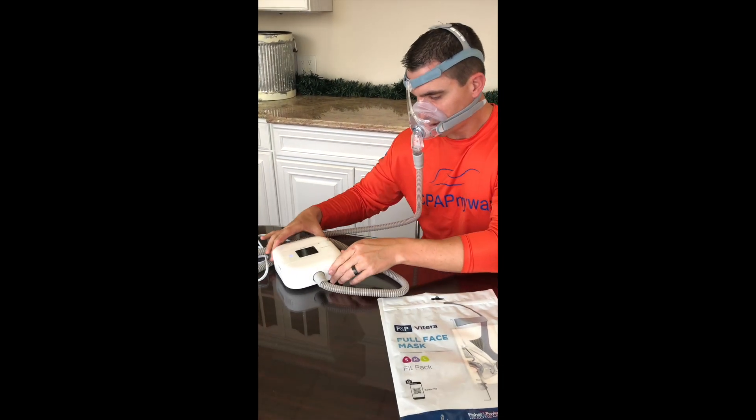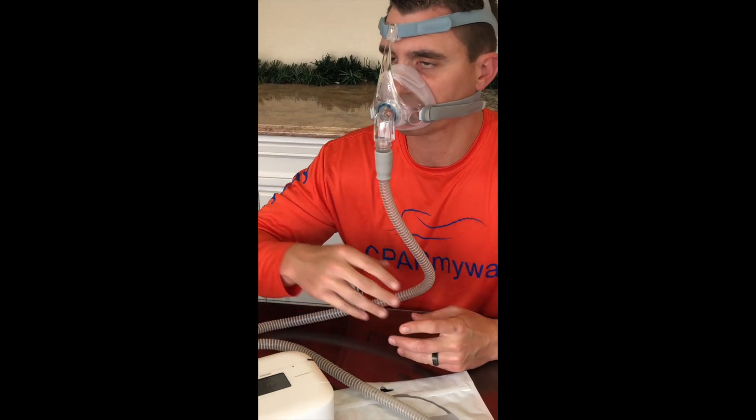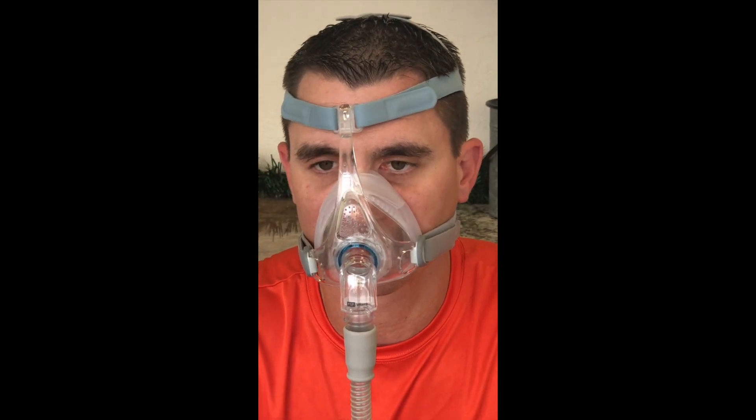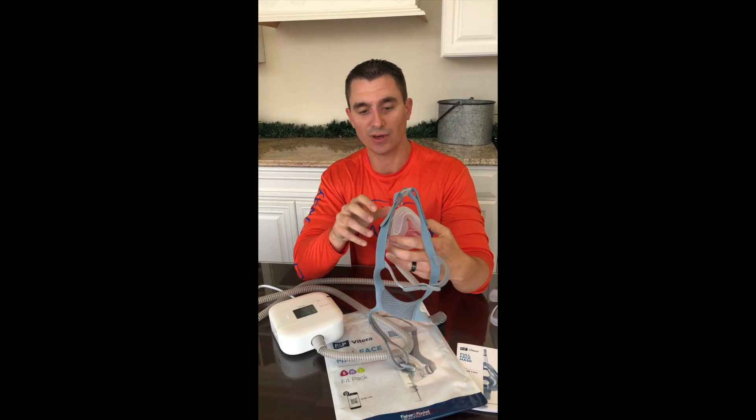And then our tubing is going to attach right on the front here. I'm going to fire it up. The exhalation port is on the front. It's a really quiet mask. It comes on and off really easily, especially with those little quick attaches, and as you heard, it's a very quiet mask.